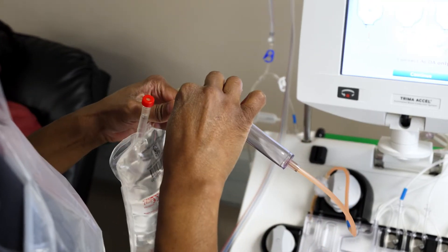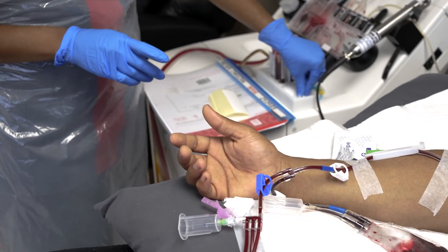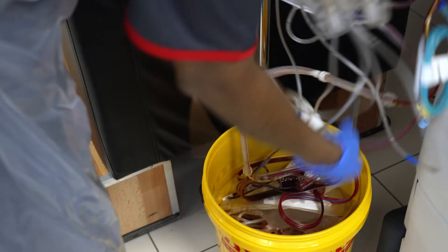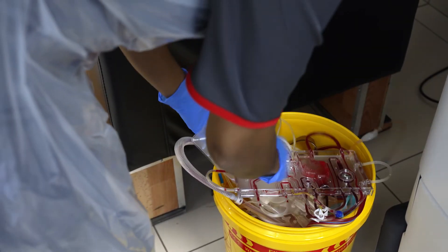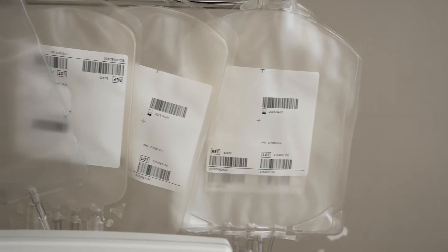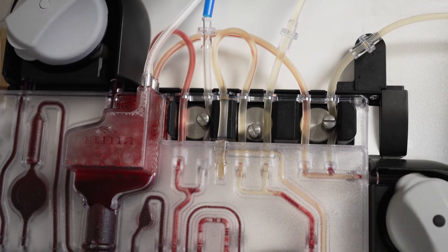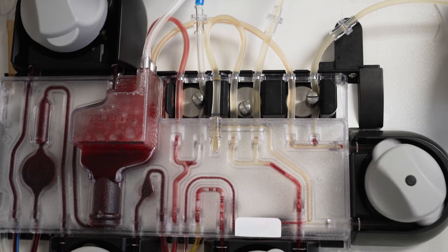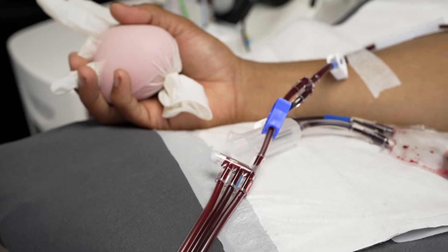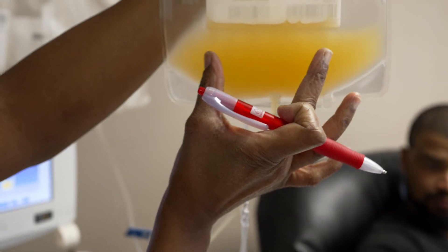During the collection of the sample, we do add some medicine to the blood to prevent it from clotting while it runs through the machine. When the sample collection is over, we remove the tubes from the machines and discard them. A new set of tubing, needles and sample collection bag is used for each donor to ensure that there is no risk of contamination with blood from other donors. The procedure of separating white blood cells is generally safe and is used in the treatment of certain diseases such as leukemias, or for collecting cells for research purposes.